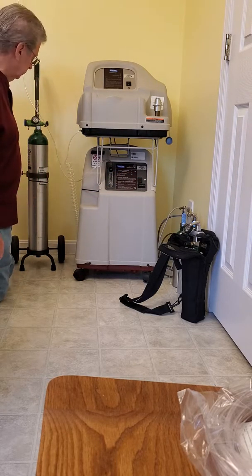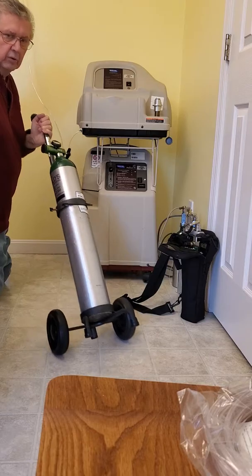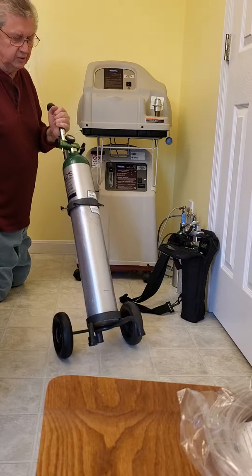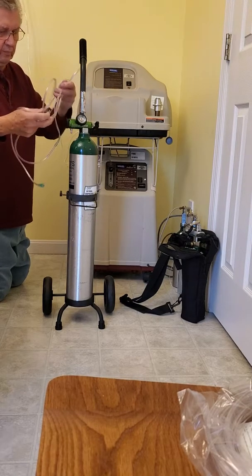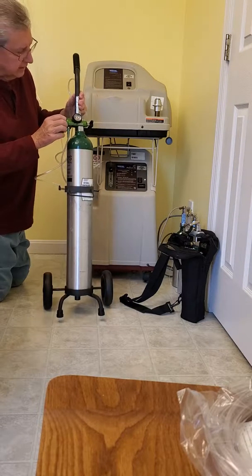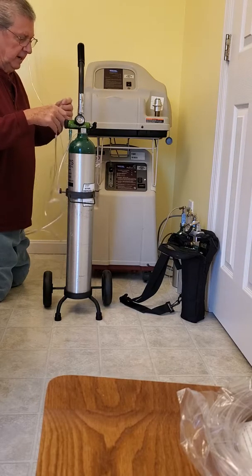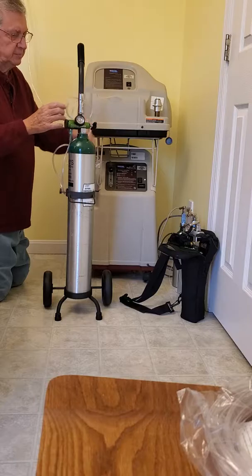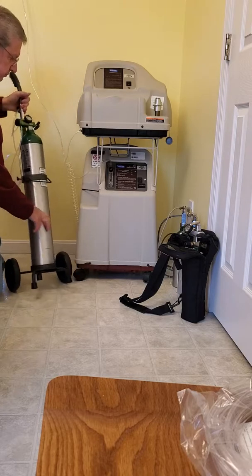Now if you're going out — say to a mall, grocery store, or somewhere — you want to take the tank with the cart. You can drag it behind you. There's about four hours of oxygen in there. You hook the tubing to it, set the gauge to where your doctor recommended — in our case it's two — and that automatically turns it on. Put the oxygen on and that's all you have to do. Remember there's only about four hours of oxygen in there.